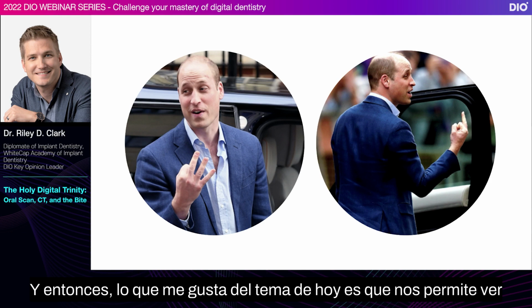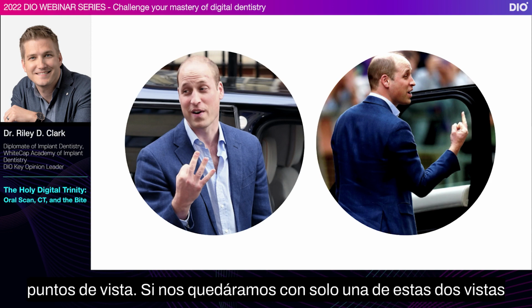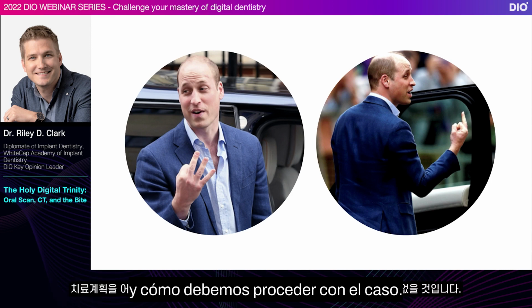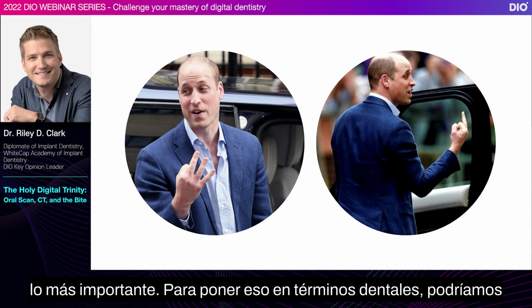What I like about today's topic is that it allows us to thoughtfully view all of the patient's parameters from every vantage point. If we were left with just one of these 2 views on the screen, we wouldn't be perfectly clear with what the diagnostic tools are representing, what the treatment plan should be, and how we should proceed with the case. So having a thoughtful plan from all perspectives is most important.